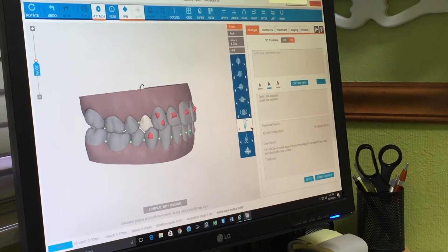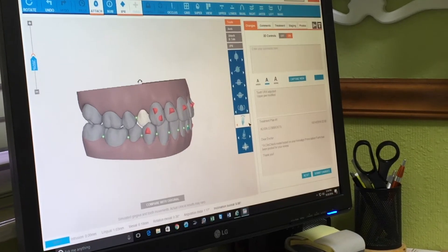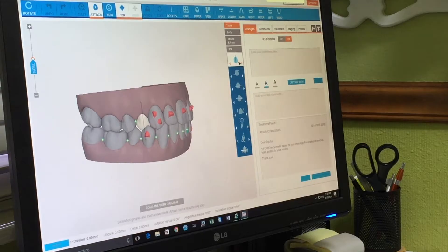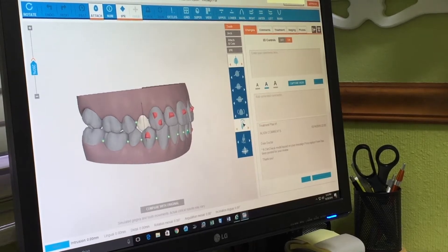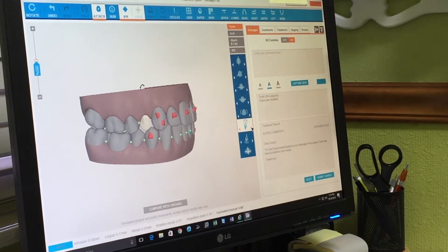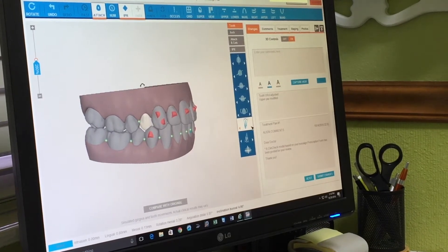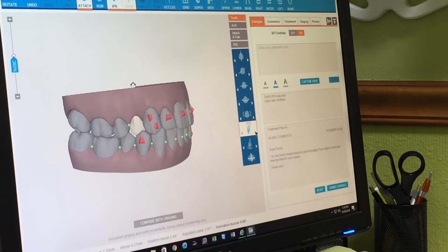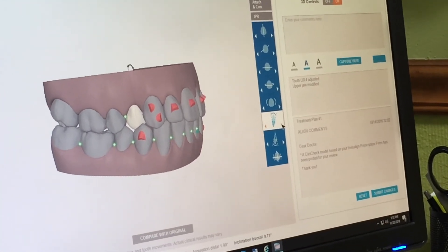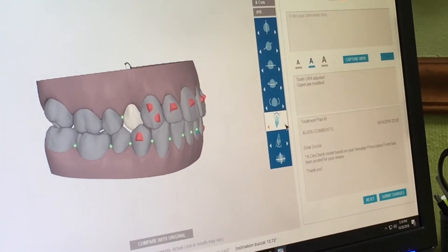What I simply do is go up here to these 3D controls. As I do on all my cases, I never accept a ClinCheck from Invisalign for what it's given to me, because there are always changes and refinements that need to be done. I have full control over moving these teeth.